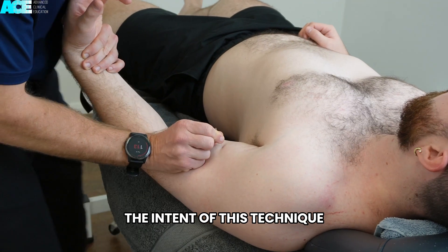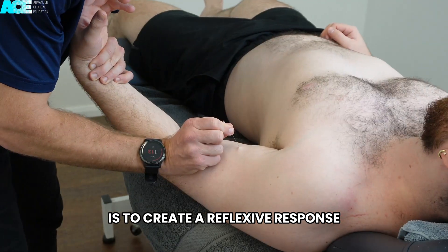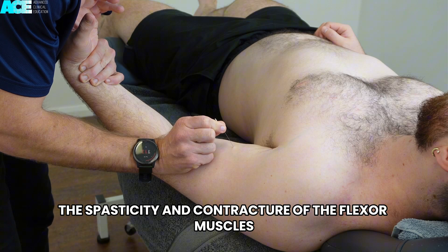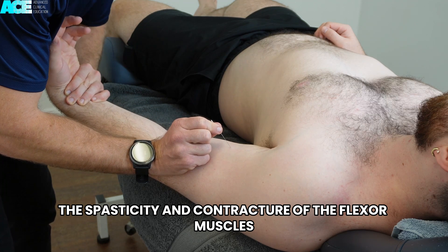The intent of this technique is to create a reflexive response with the stimulus from the needle, to decrease the spasticity and contracture of the flexor muscles.